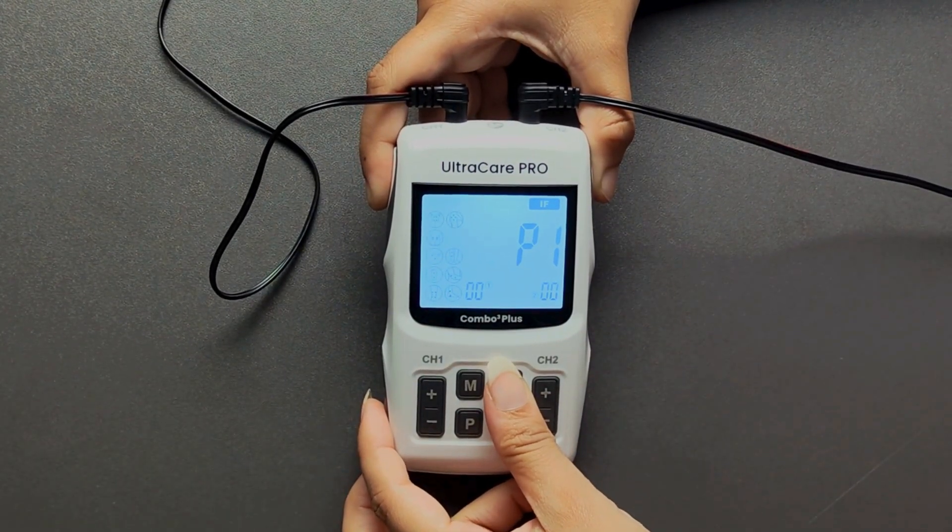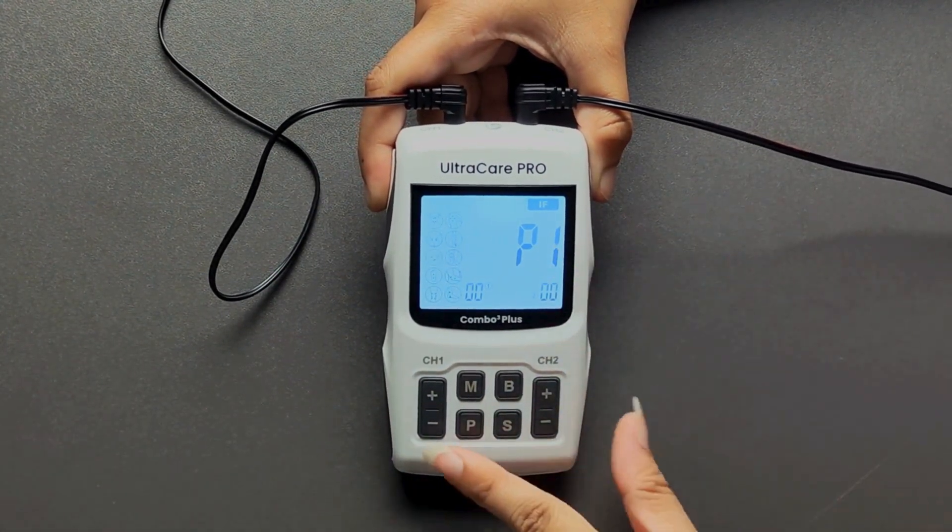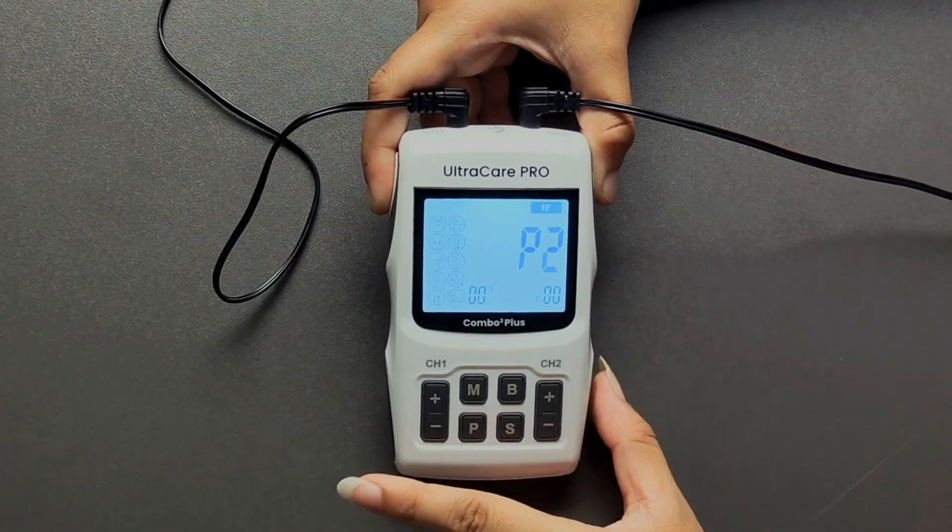Press B to choose the body part you want to treat and press P to select the program type from P1 and P2.